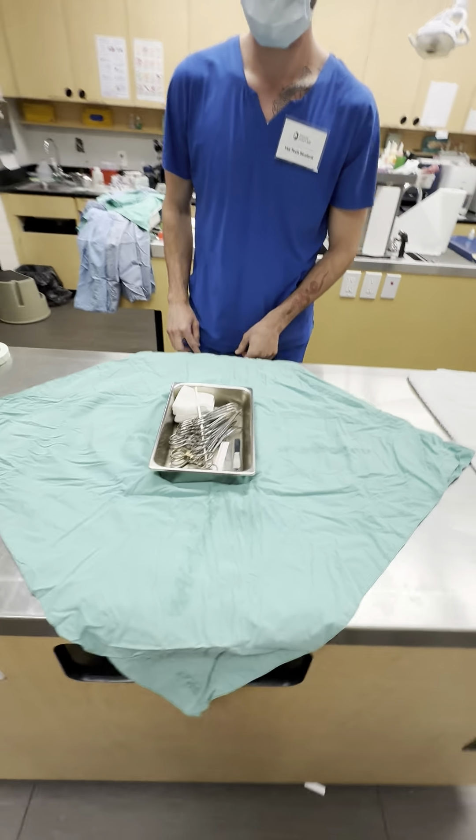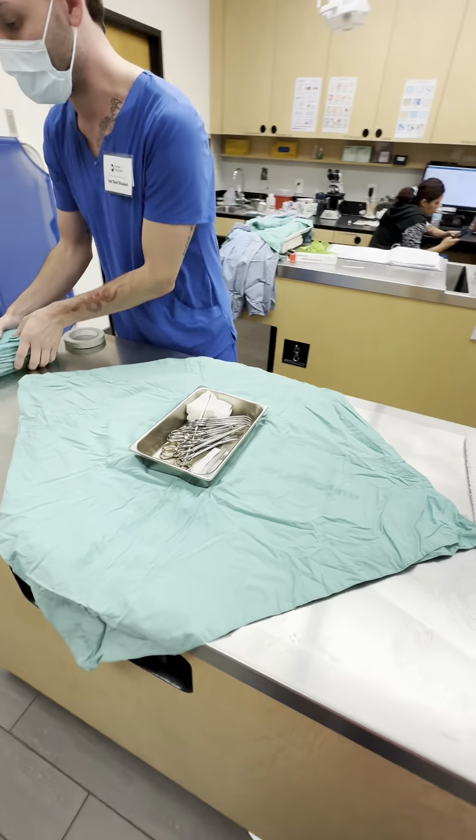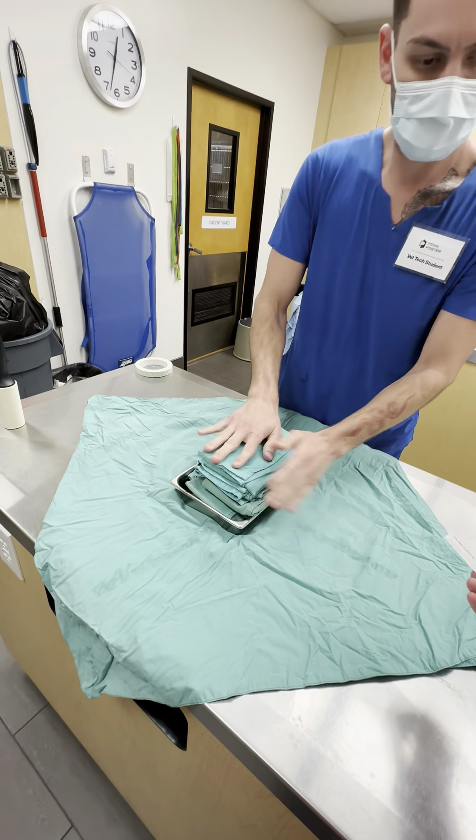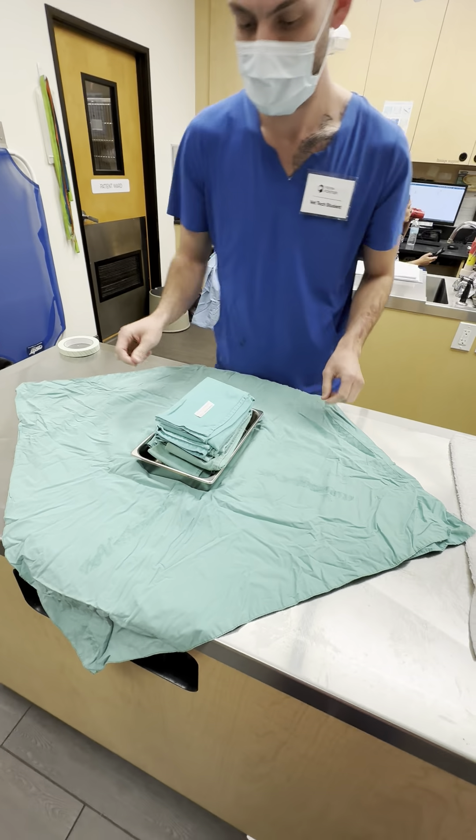Did you lint roll your towels? Yes, I did lint roll my towels individually. And then just put your other one on top.